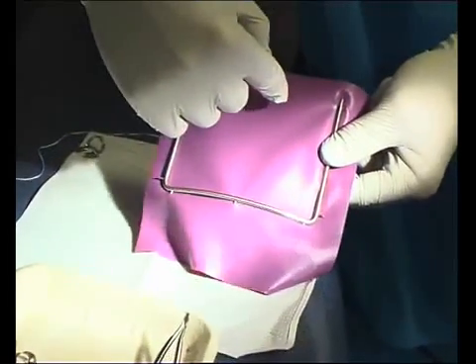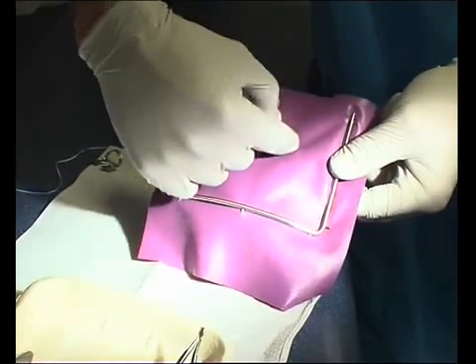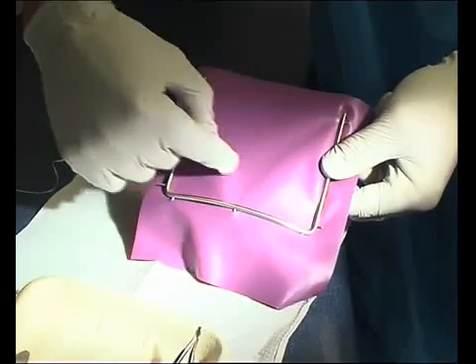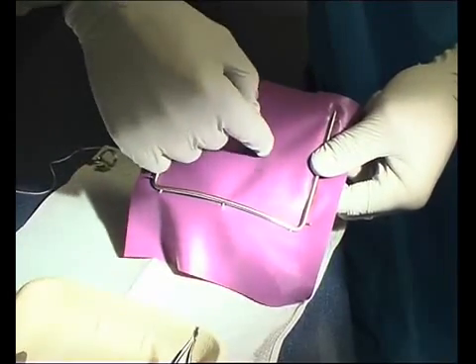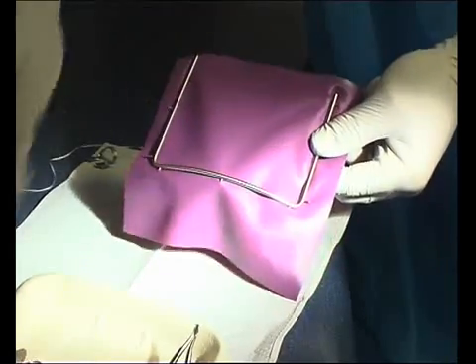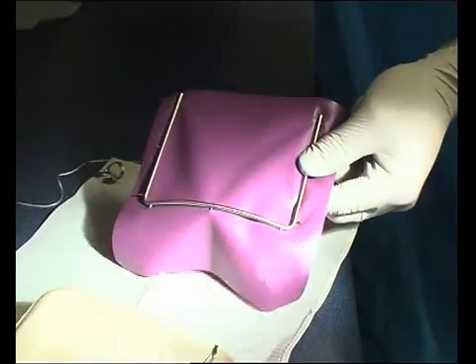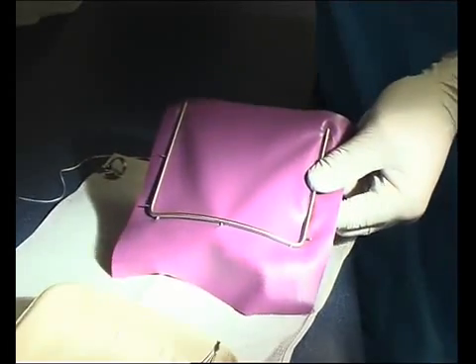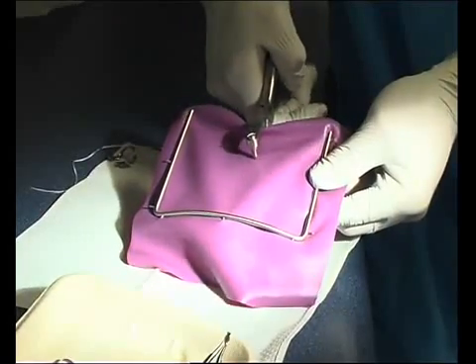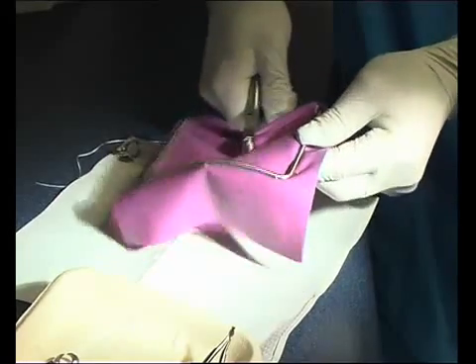So if we imagine the lower left quadrant, it would be something like an inverted J running around like this. So if we're going to clamp for a molar, we're going to place the hole somewhere in the middle here. So let's just imagine we're going to do this for root canal treatment — we're just going to put one hole in, because we're just going to isolate one tooth. So we're going to do a little hole somewhere there.